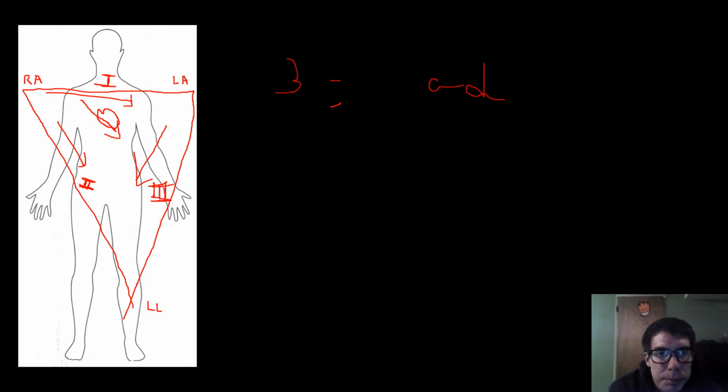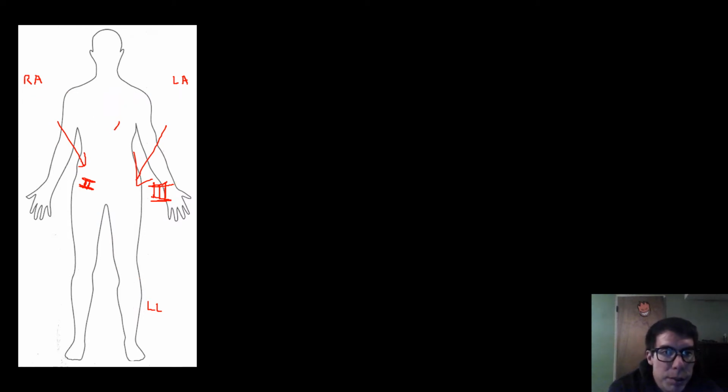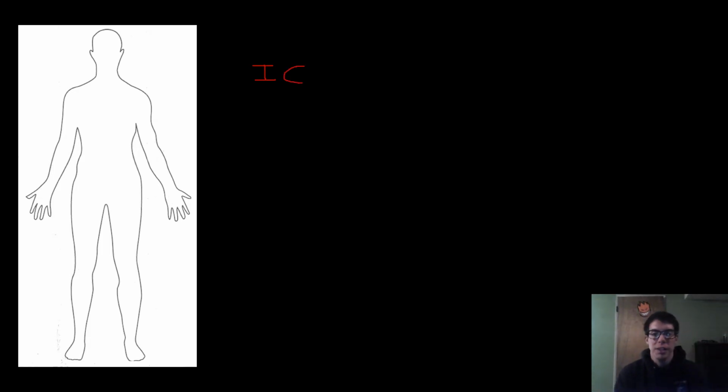Alright, so now we'll talk about 12-lead placement real quick. I'm going to use the term IC for intercostal, because I don't want to have to write out intercostal every time, because that would take forever. So just know that's what I mean by that.